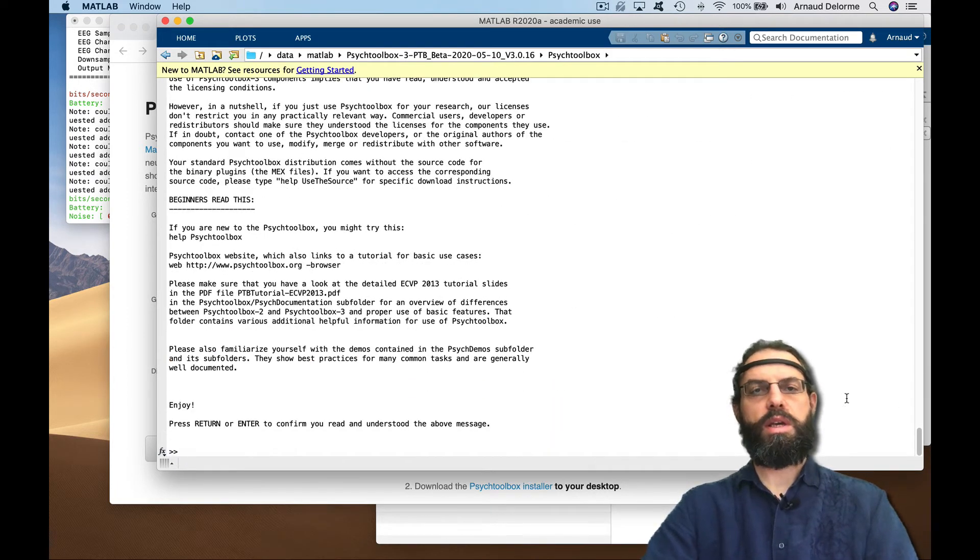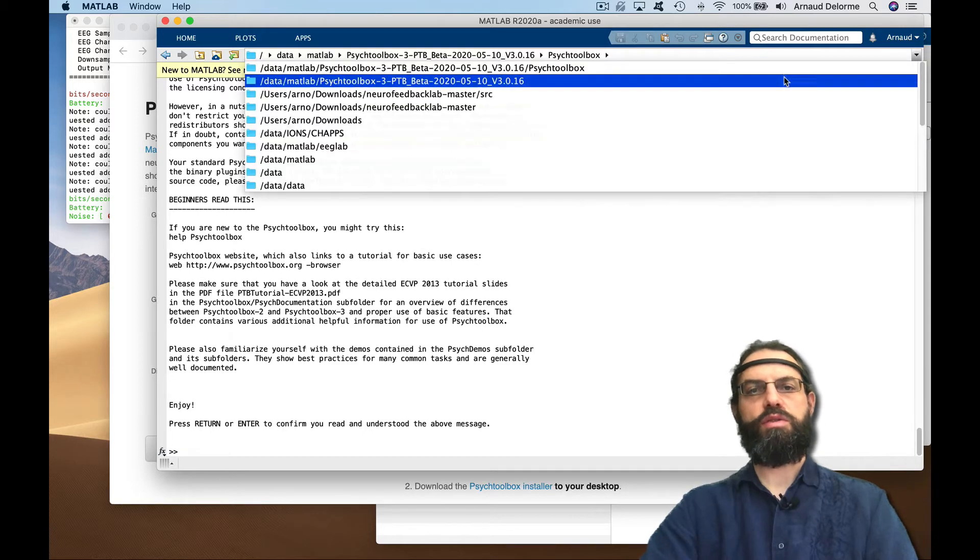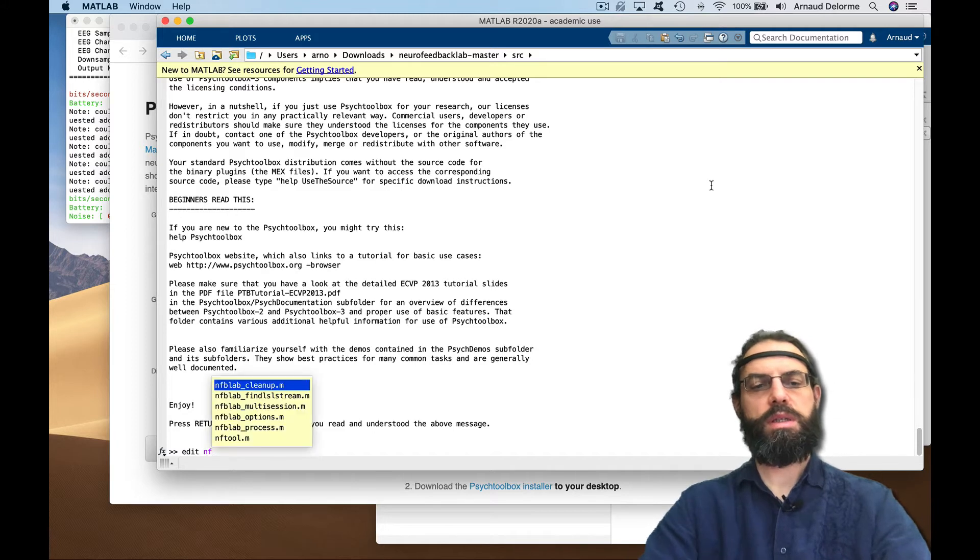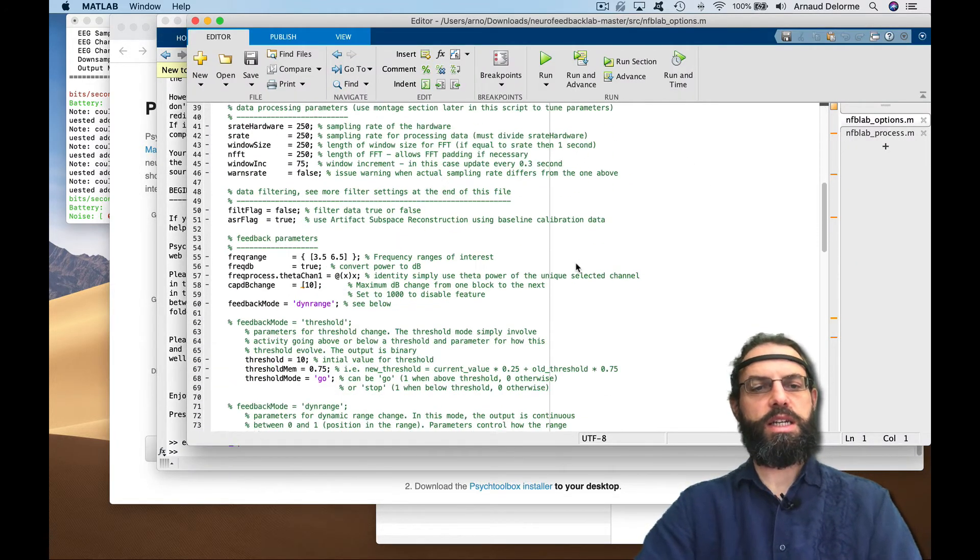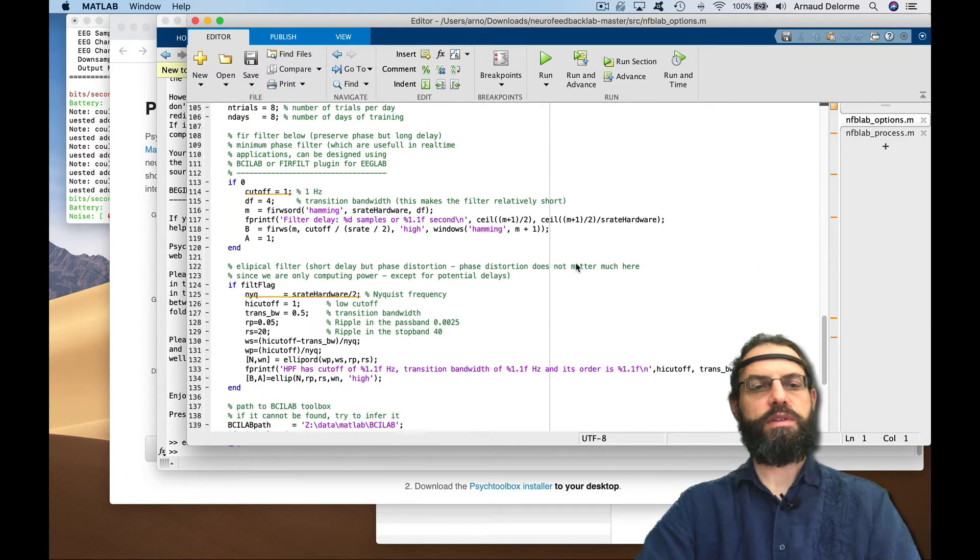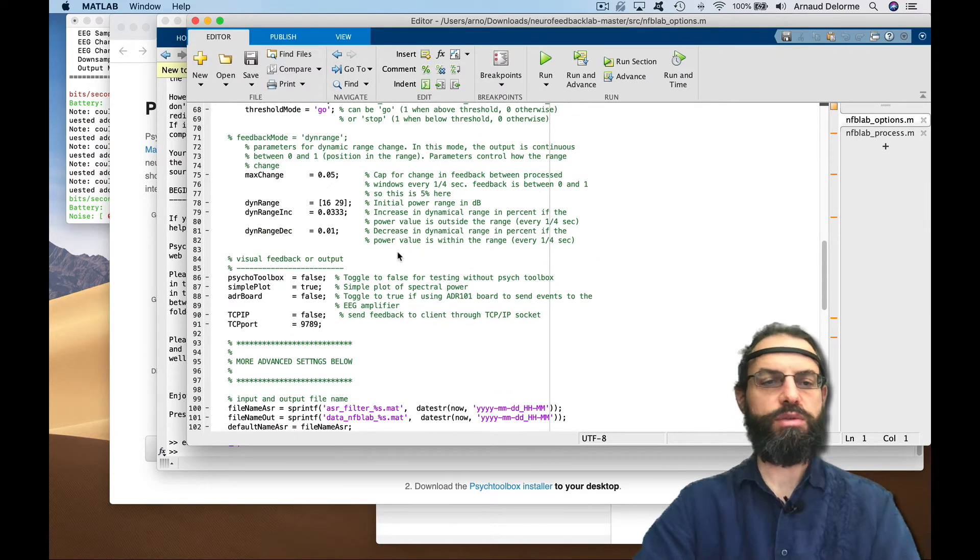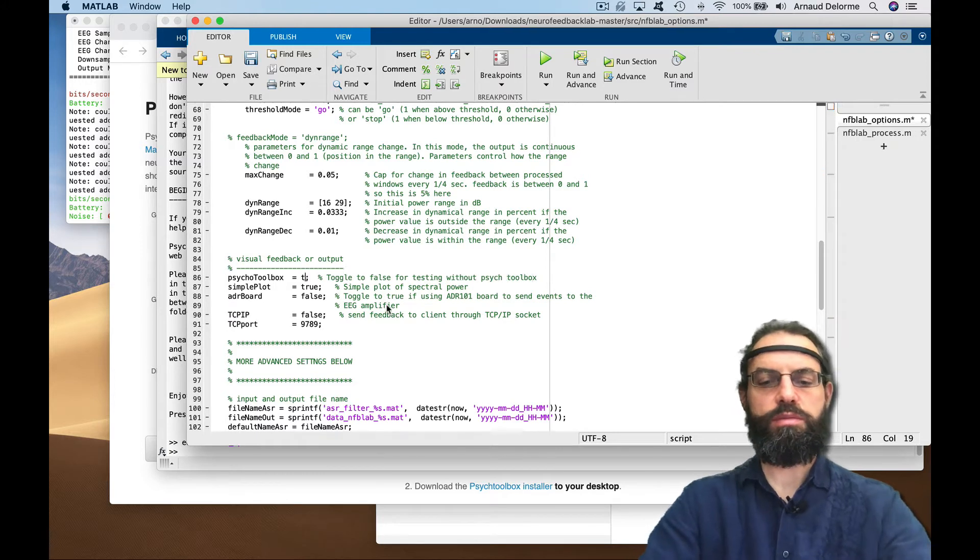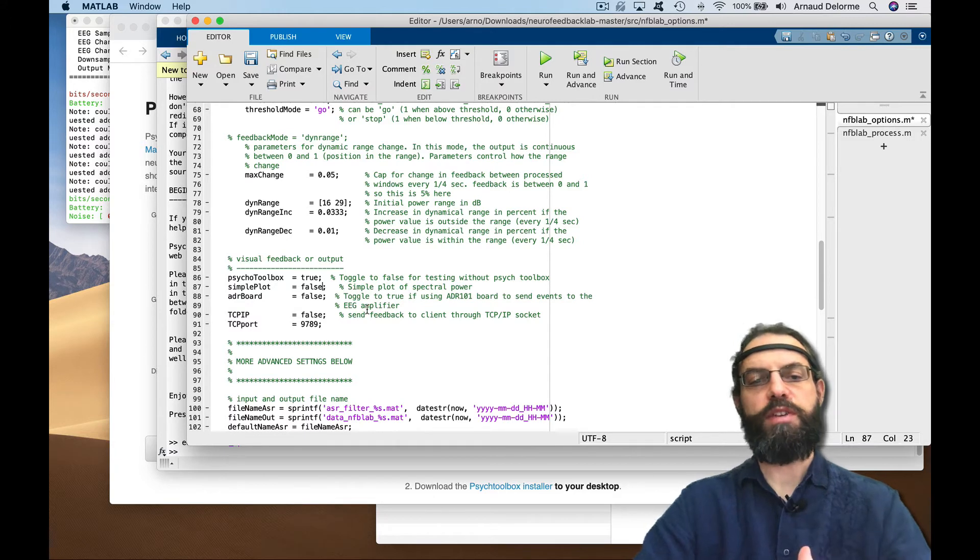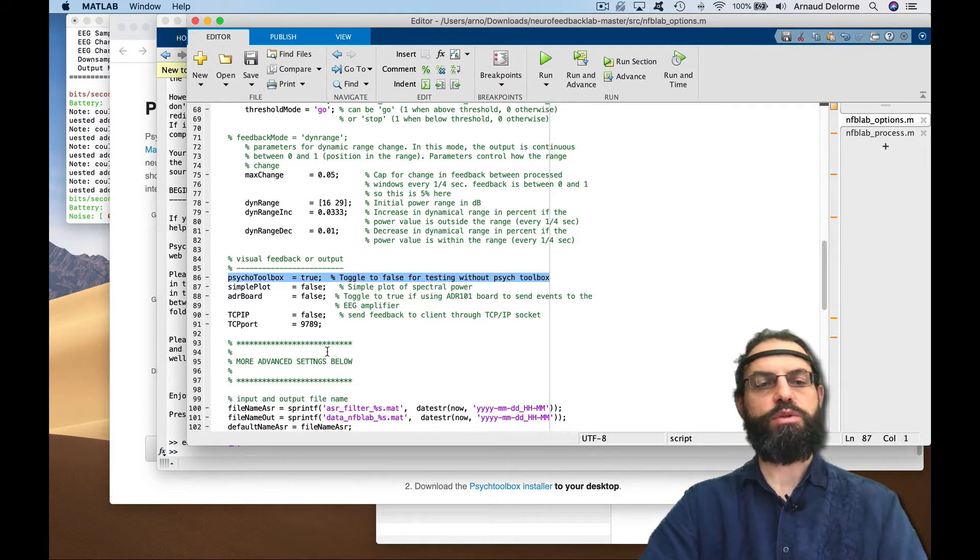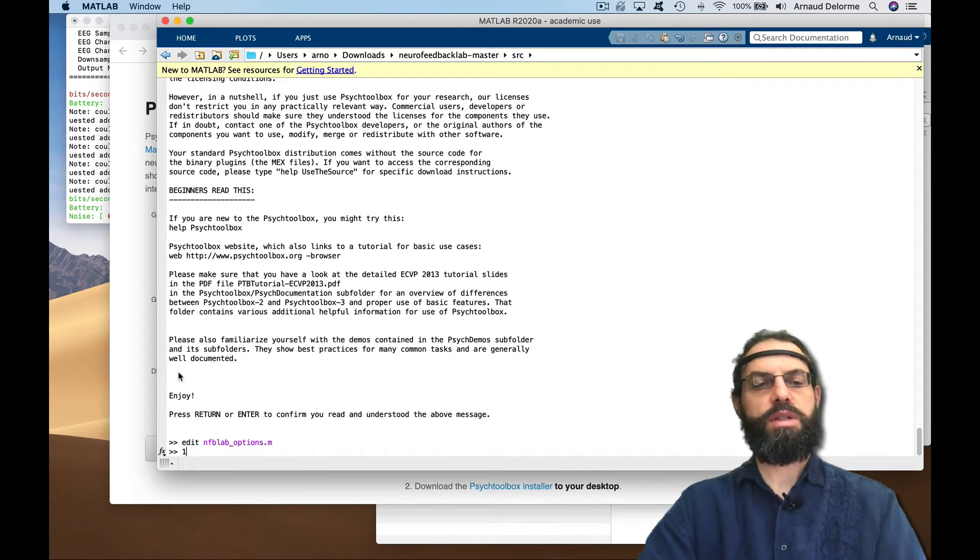Now it's installed. I go back to my folder and have to change the options. There's many options—there's another video with all the options you can use. The psycho toolbox here I'm going to turn to true. I can do the simple plot or both at the same time. You have to change this parameter, psycho toolbox, to true.